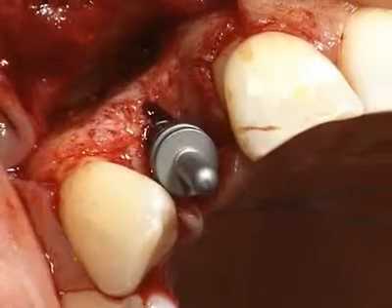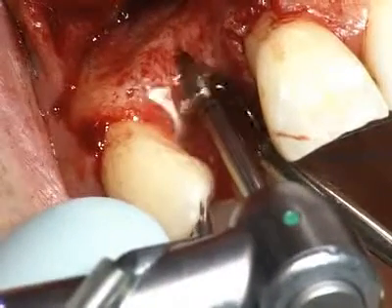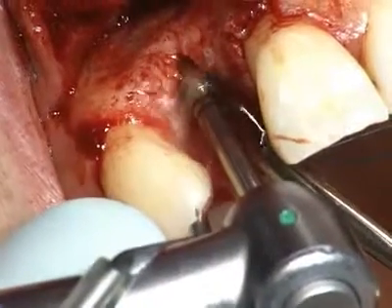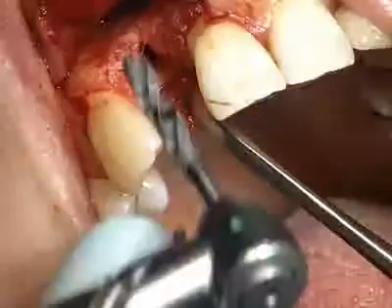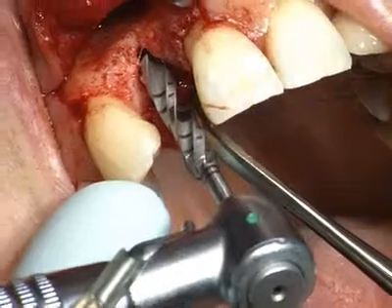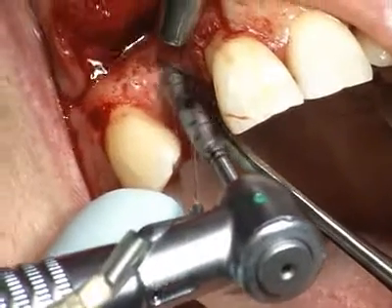To make it easier to fix the next sized drill in the hole, the bone margin can be flattened slightly with a 2.8 mm diameter profile drill. The implant bed is widened with the 3.5 mm diameter twist drill at a maximum speed of 500 rpm.